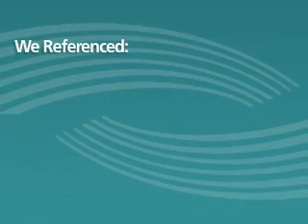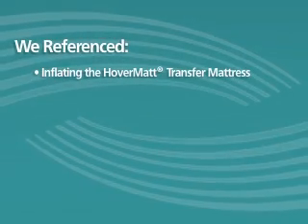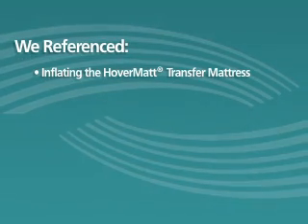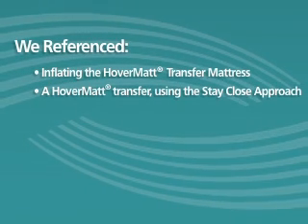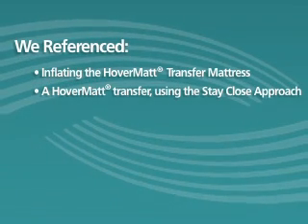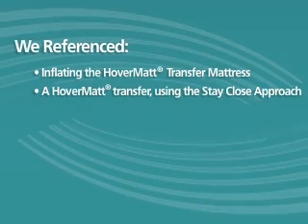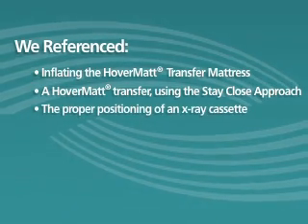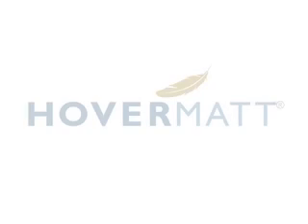In this section, we reference the correct procedure for inflating the HoverMatt transfer mattress, taught in the Using the HoverMatt Air Transfer System and HoverTech Air Supply video. A HoverMatt transfer, using the Stay Close approach, taught in the Using the HoverMatt Air Transfer System and HoverTech Air Supply video. The proper positioning of an X-ray cassette, explained in the Using the HoverMatt Air Transfer System in the Emergency Department video.